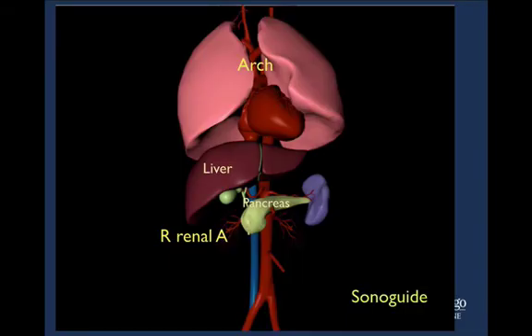Mostly today we will concentrate our efforts on the abdominal aorta down to the level of the bifurcation of the common iliac arteries. If we have time at the end of our session, we will also visualize the proximal aorta as it arches in the chest.